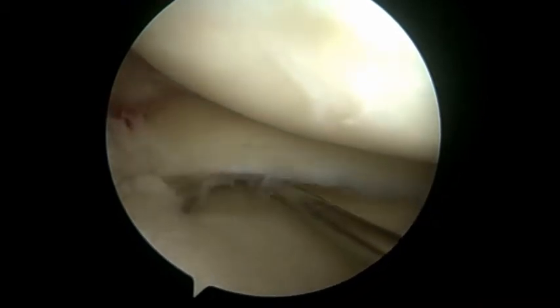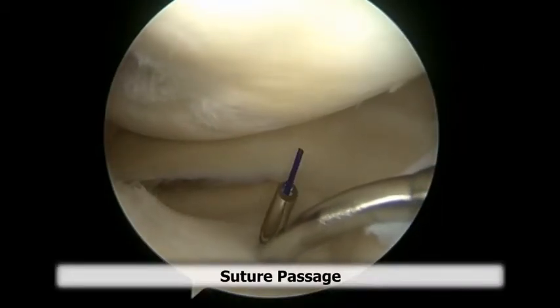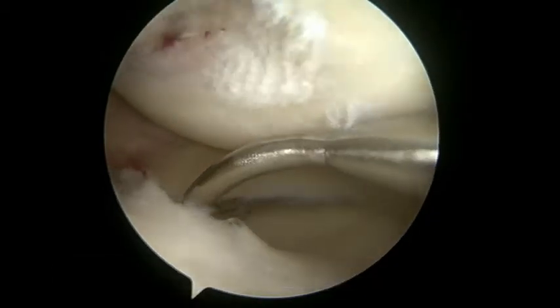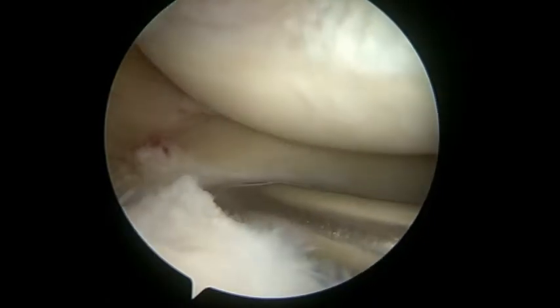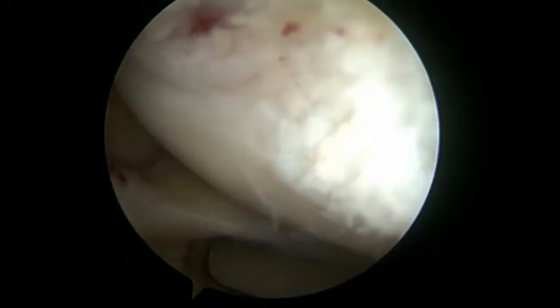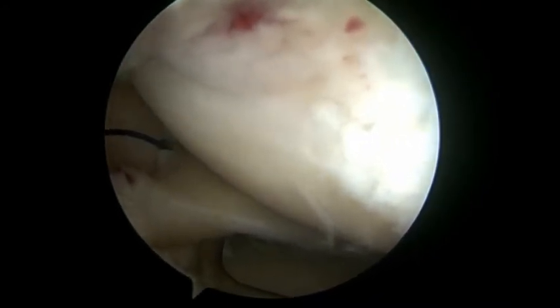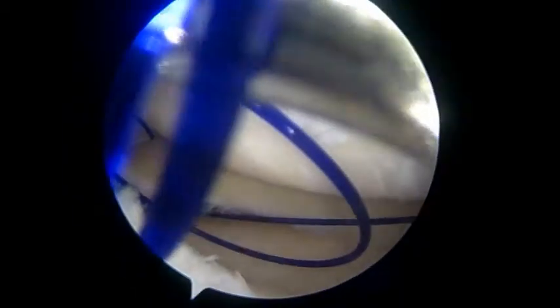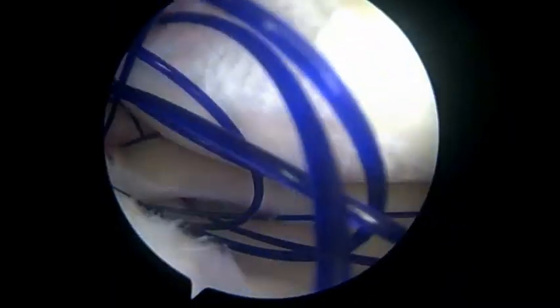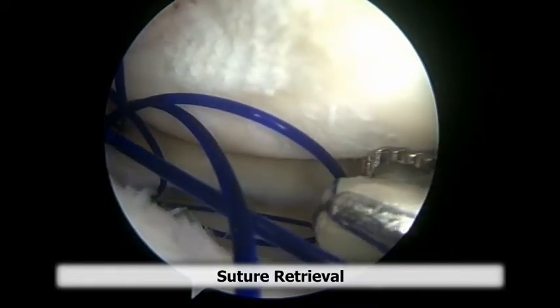A zero PDS will be used to shuttle the sutures through the meniscus. Here a standard curved suture passer is used to shuttle the PDS through the meniscus. You can then see the free end of the PDS retrieved through the medial portal.